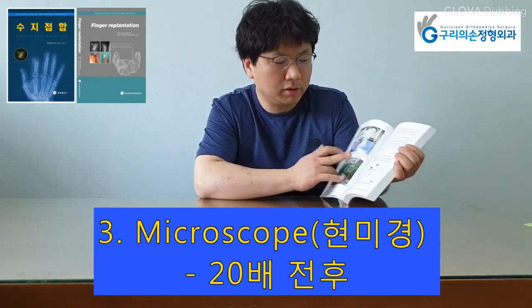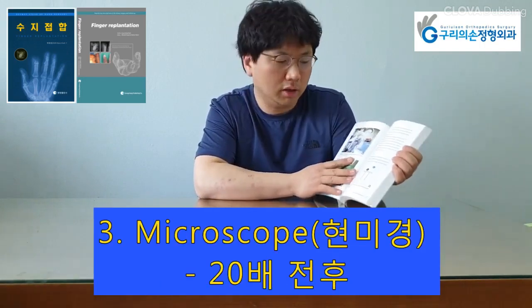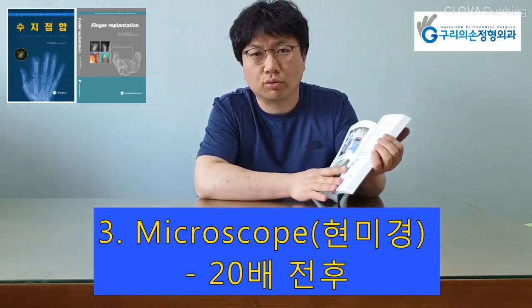Table and Chair. For fingertip replantation, 20 times magnification is preferable.